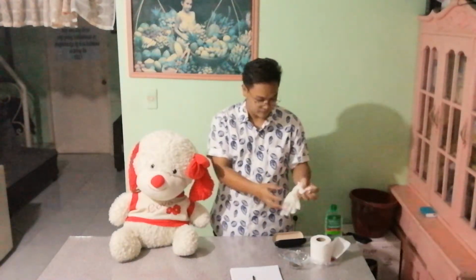So for our 11th step, we need to remove our gloves and perform hand hygiene. So for our 12th step, we need to place the bed in the lowest position.